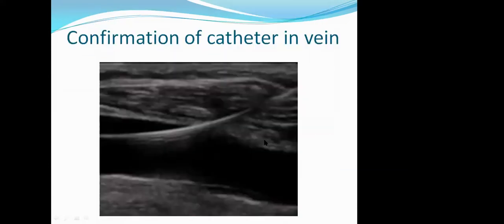The last step is that in a longitudinal plane, you will see the entire length of the catheter or the wire inside the vein.